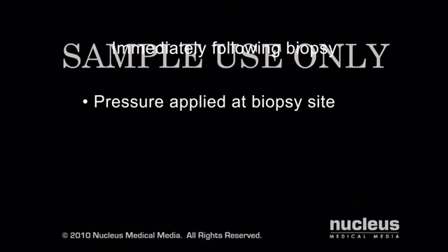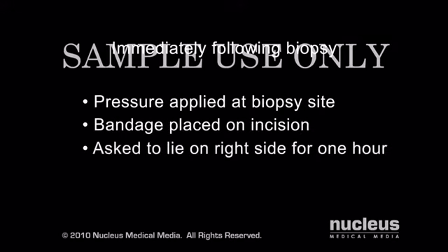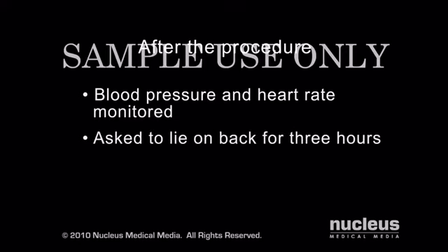Afterward, pressure will be applied at the site of the biopsy to stop any bleeding, and a bandage will be placed on the incision. You will need to lie on your right side for a minimum of 1 hour following the biopsy. After the procedure, your blood pressure and heart rate will be closely monitored. After lying on your right side for an hour or 2, you'll be asked to lie on your back for a minimum of 3 additional hours.